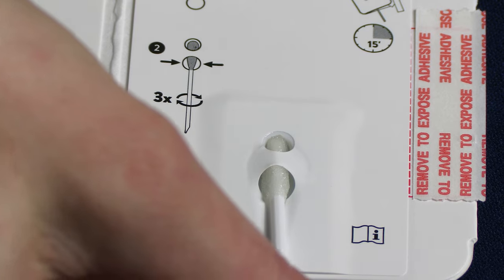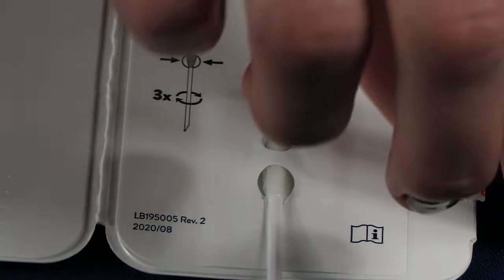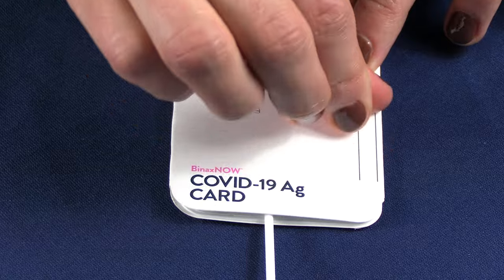Remember, keep the card flat on the table. Keep the swab in place, remove the adhesive, and close the left side of the card over to seal it. Keep the card facing up. Do not touch or move the card.